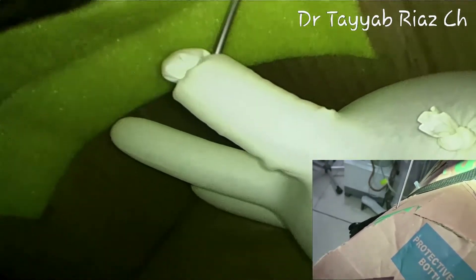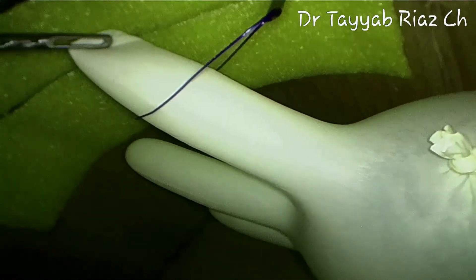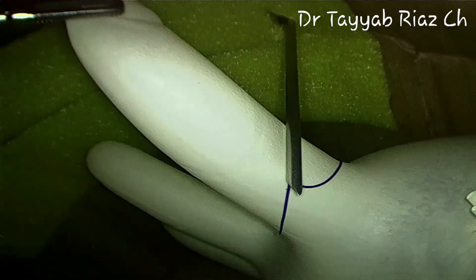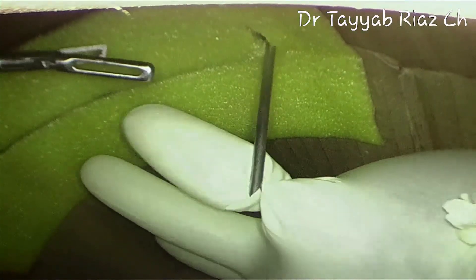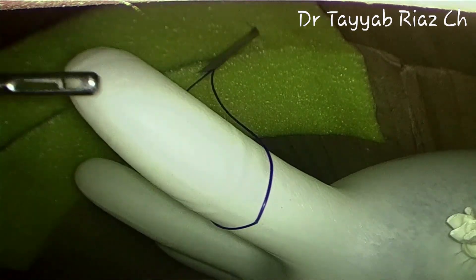You can work on the mesoappendix for dissection, either with the help of a LigaSure or tie it with an extracorporeal knot. If the appendix is long, you can also loosen the loop and hold the appendix further proximally for easy handling and manipulation. When the job is done, remove the loop and bring it out through the Veress needle.